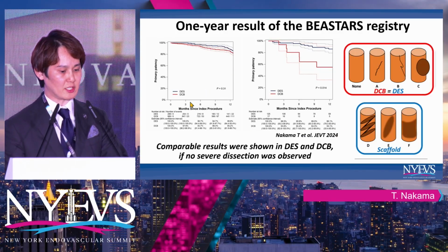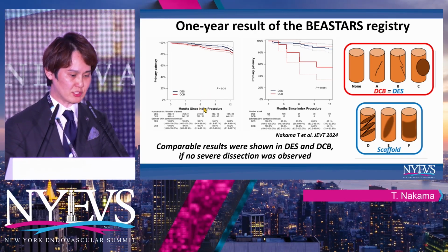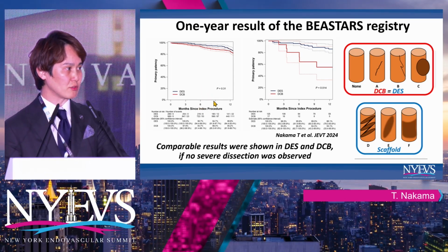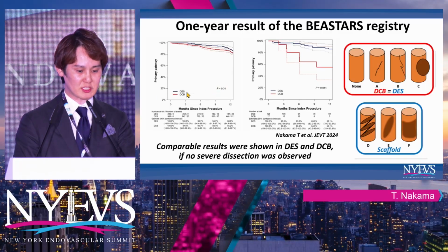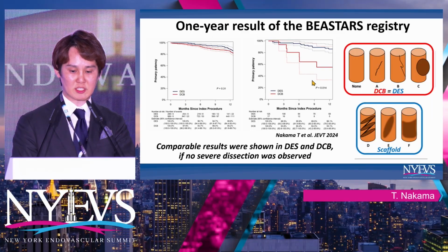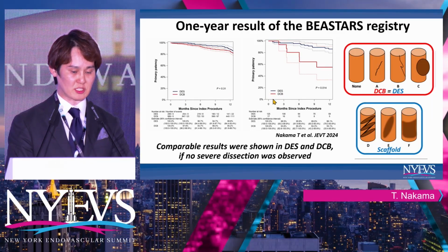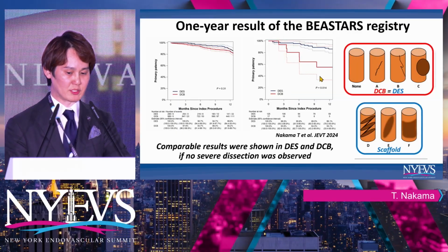As you can see, if we compare DES and DCB with a successful lesion preparation, meaning no significant residual stenosis and no severe dissections, DES and DCB show almost the same result. And if you look at the severe dissection case, DCB showed an unfavorable result.